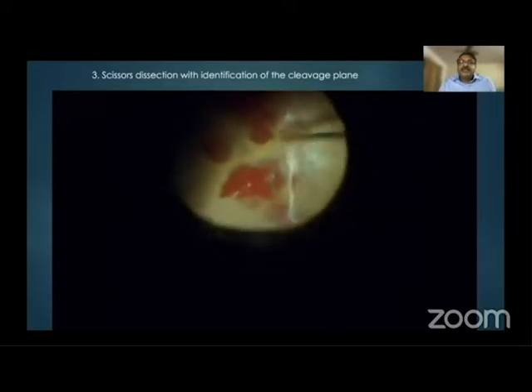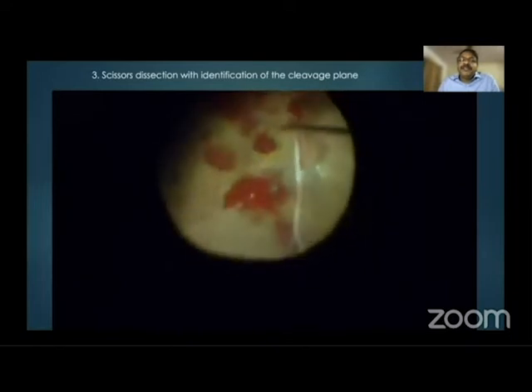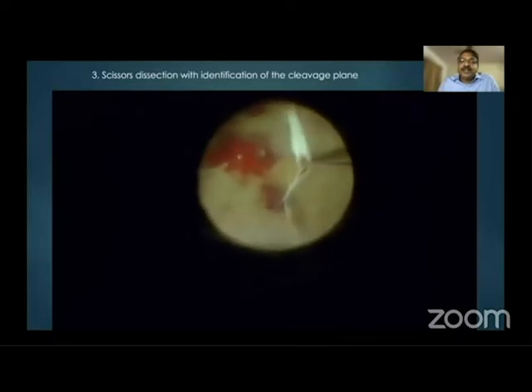This way, the scissors is a very efficient dissecting tool. And you could safely dissect this membrane without having any iatrogenic tears.